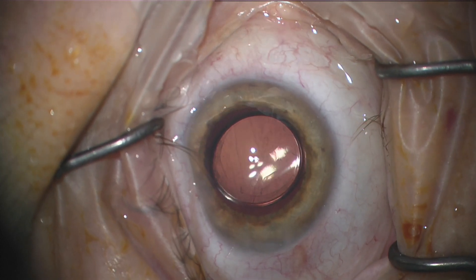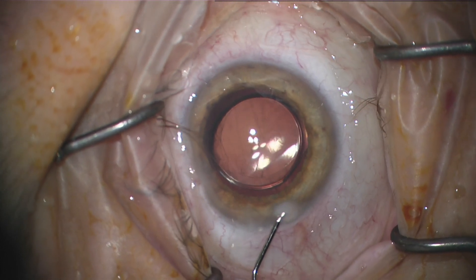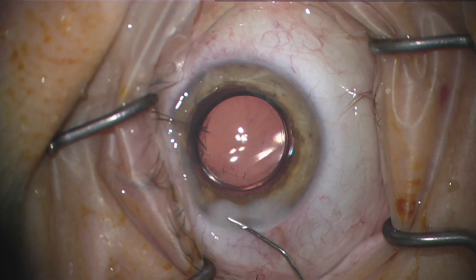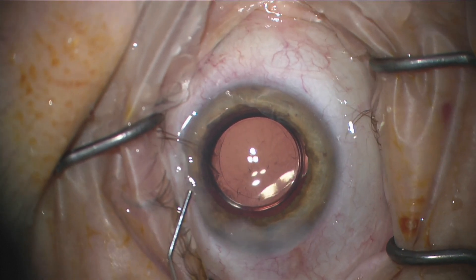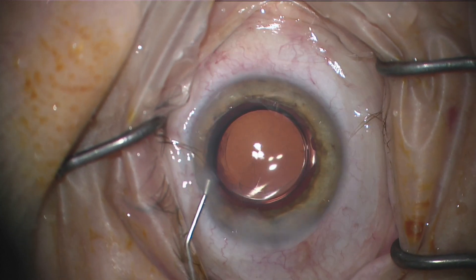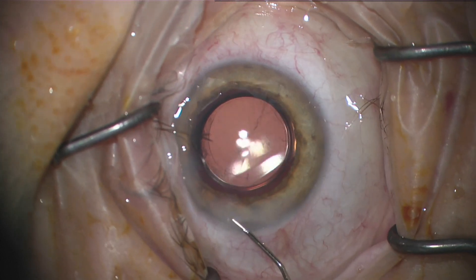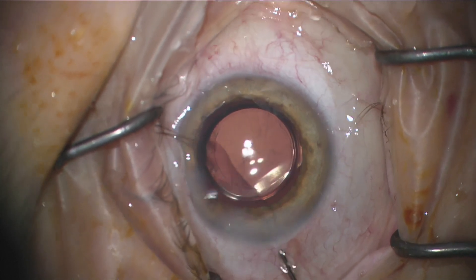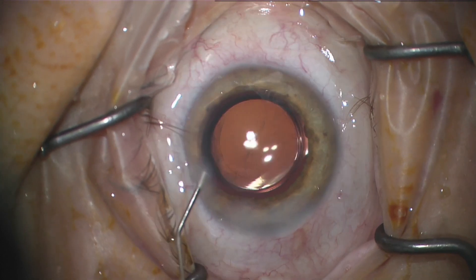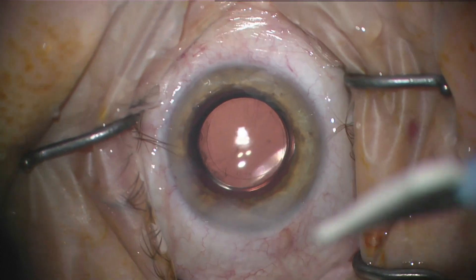Another gripe: you aren't controlling the fluid with a foot pedal — there's no foot pedal, which is nice in a way, but your tech is controlling it. You have to tell them when to clip the fluid on and off, similar to how it works with some retina vitrectomy machines. So I have to tell them to clip it on and off to stop the fluid.